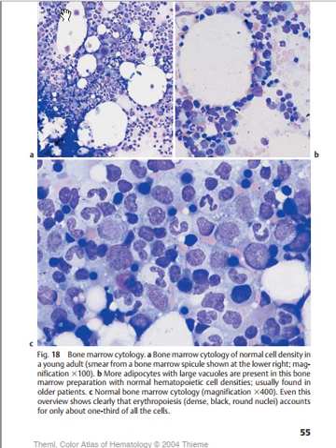The stroma is the tissue which is used to anchor or adhere the functional tissue of an organ. Here the stroma is made up of adipose tissue and some connective tissue. And then here we have the parenchymal cells, like the promyelocytes and the different cell series inside the bone marrow.